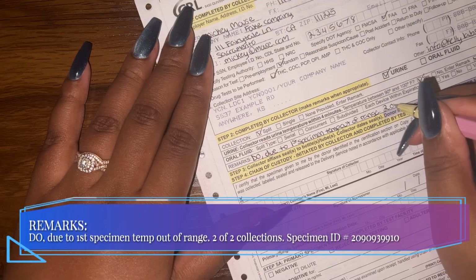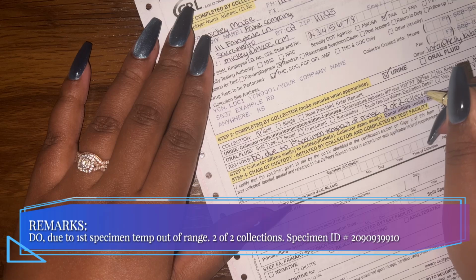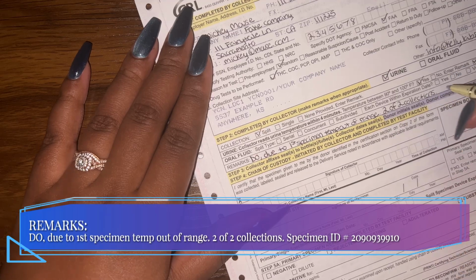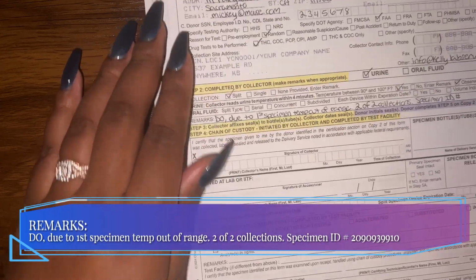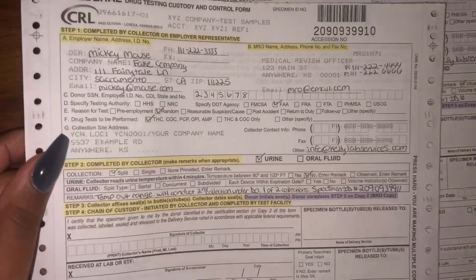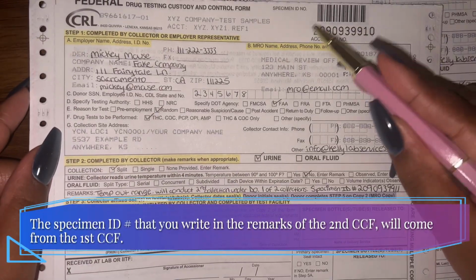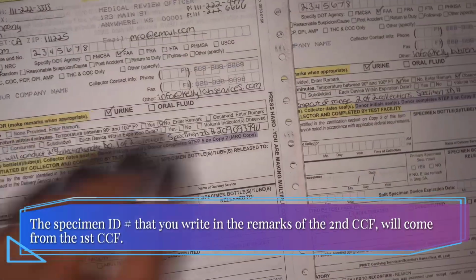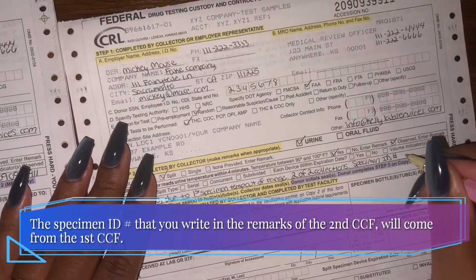2 of 2 collections, specimen ID number, and then we're going to take that specimen ID number that was on the temp out of range CCF, our first CCF, this number up here, and write it into our remarks on our second CCF form.